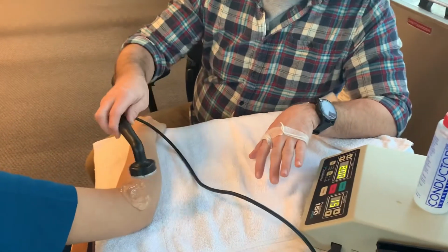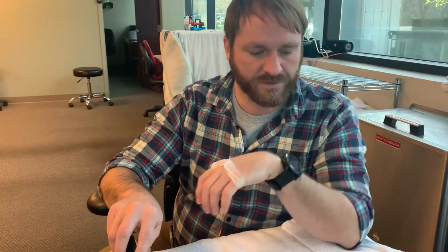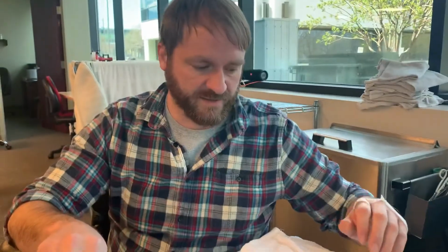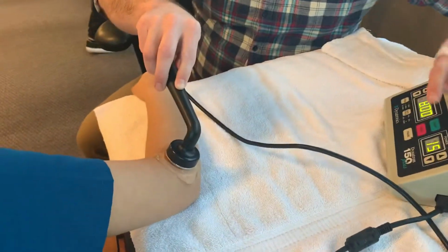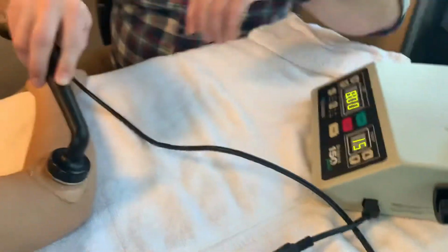So when we go on to the 1 megahertz setting, to get a similar heat, we're probably going to want to go a little bit higher than 1.5 on the intensity. Watts per centimeter squared is what that is. So I've got the sound head on the treatment area. I'm going to hit start.